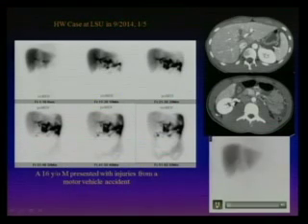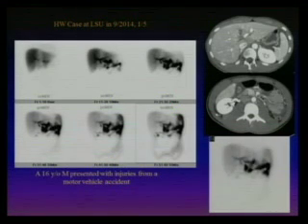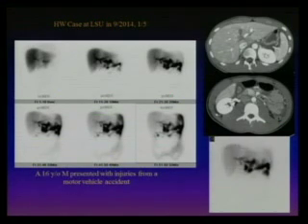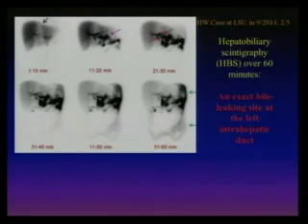So the trick when you start on call, especially with a leak study, is don't let the technologists go. Tell them to call you immediately and wait for you to come down to look at it, because you may have difficulty displaying it on the screen, and they can help you. This was in the middle of the night. They called me like 1 a.m., and fortunately the technologist was still in the hospital. So I let her use FaceTime on the cell phone and show me the images so I could make the diagnosis. Otherwise, they are waiting to go to surgery. That's the key.